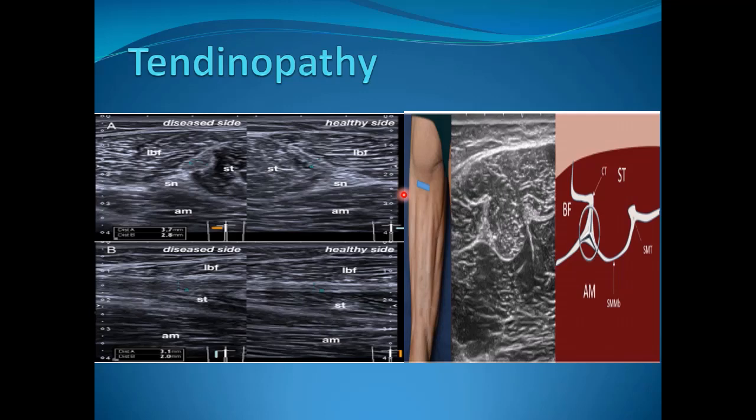A quick review from the previous study of the normal anatomy of the upper posterior thigh: in the hamstring region we see the hyperechoic band of the sciatic nerve anteriorly. The common tendon of the semitendinosus and biceps femoris is noted here, along with the semimembranosus tendon and the adductor magnus muscle.